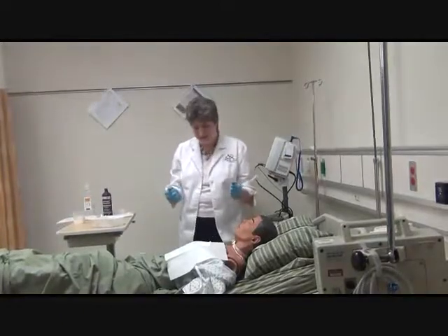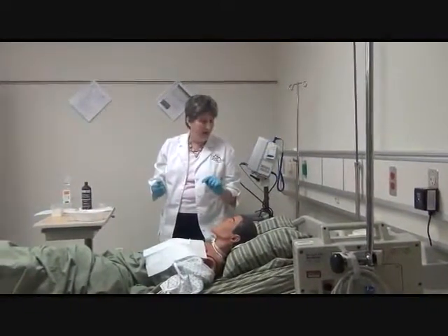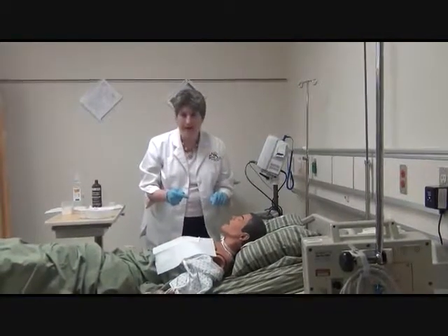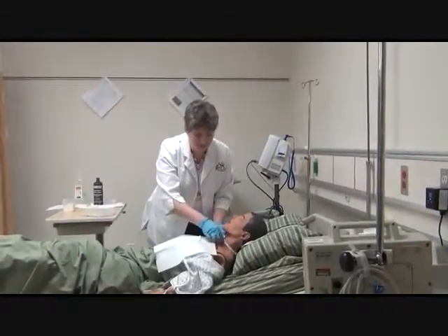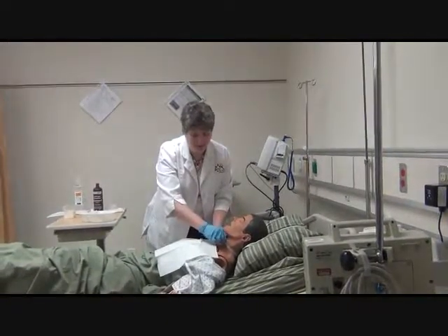The last part of this is we need to get that tie off and change, and this is where it can get really kind of tricky. Once I start and I have untied the knots, undone the Velcro, whatever the piece is, we're going to never let go of the faceplate.